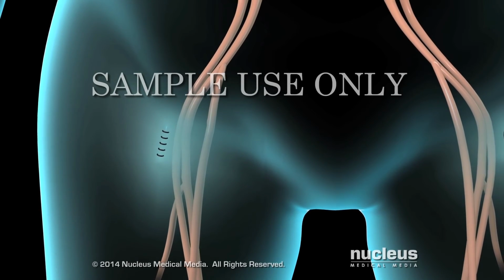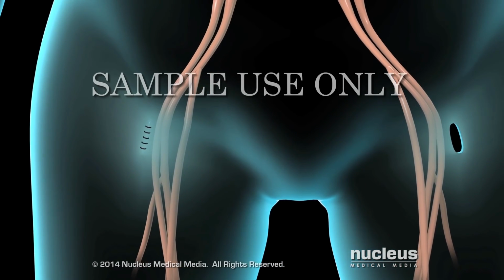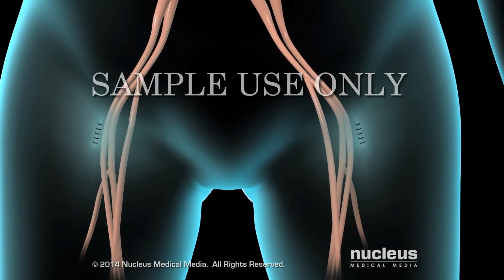You will have another incision on the other side of your groin, through which instruments were inserted to monitor your heart during the procedure. This skin incision will be closed in a similar manner.